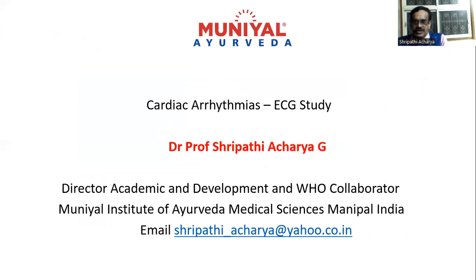So today's topic is cardiac arrhythmias, the ECG study. Cardiac arrhythmias are mainly of two types. One, due to disorders of impulse production. Number two, due to disorders of impulse conduction. Impulse production disorders are sinus tachycardia, sinus bradycardia, supraventricular atrial tachycardia, atrial flutter, atrial fibrillation, ectopic beats, escape beats. These are the main types.